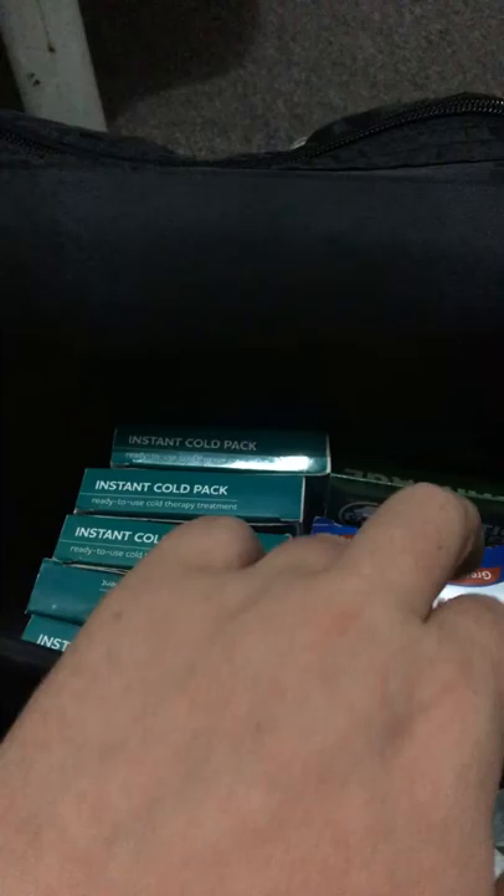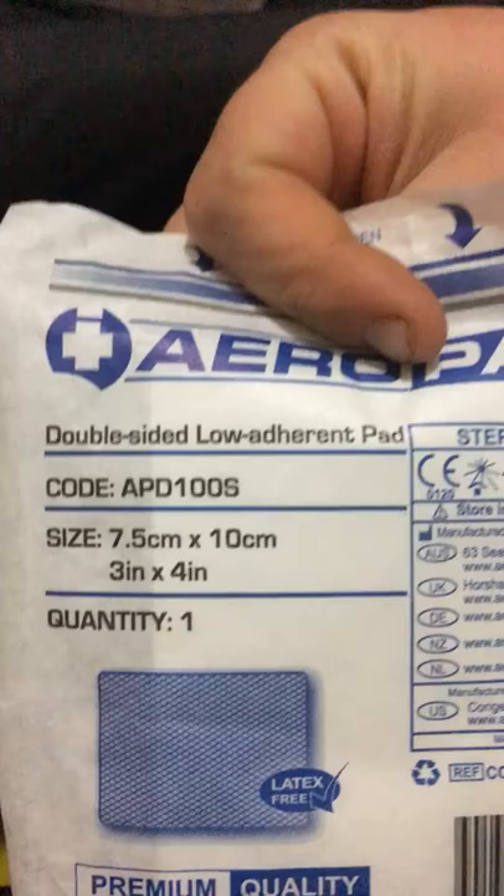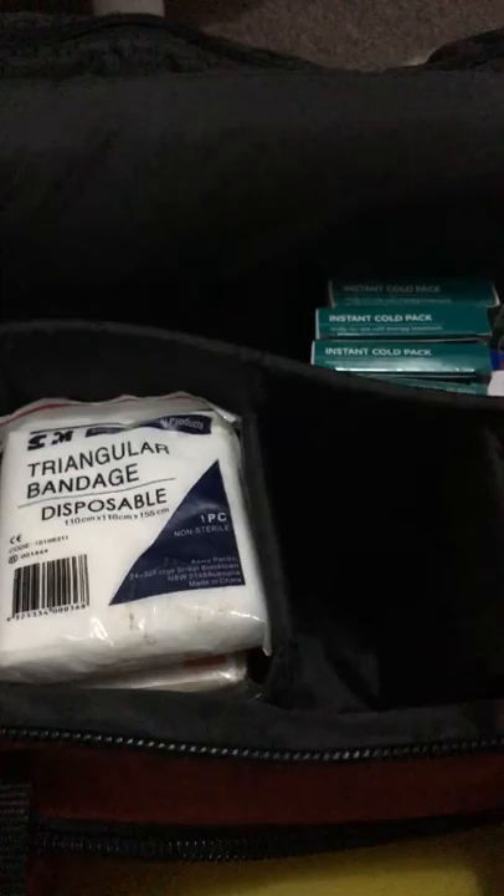In the front compartment I also have assorted size bandages times twelve. There are five instant cold packs, one set of triangular bandages — seven of them — and three saline solution bottles, plus three combined dressings.